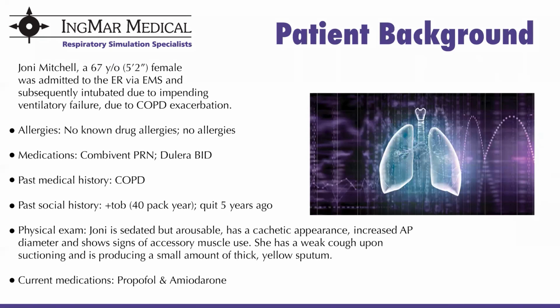During stage 1 of this scenario, the learner was required to correct for inadequate ventilation by increasing the tidal volume on the ventilator. Now, the simulation has advanced to 4 hours later, at which point our patient has become desynchronous with the ventilator.